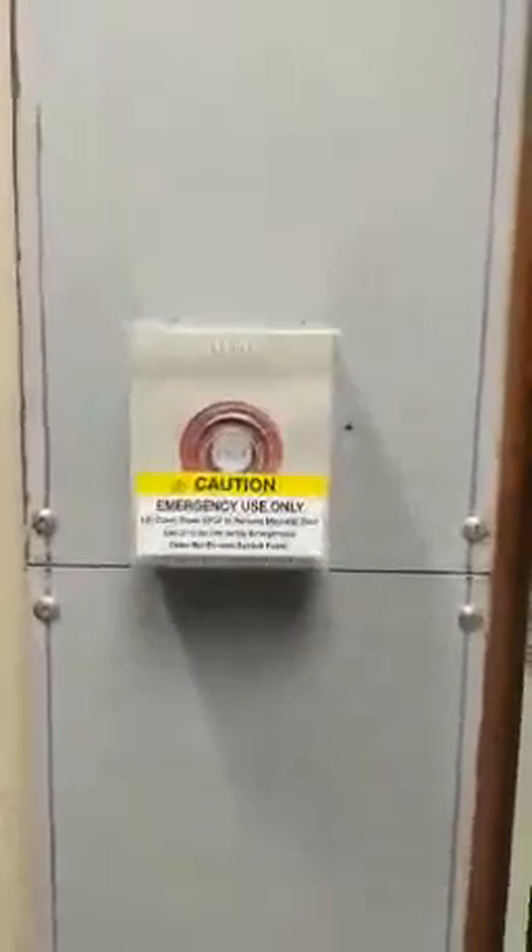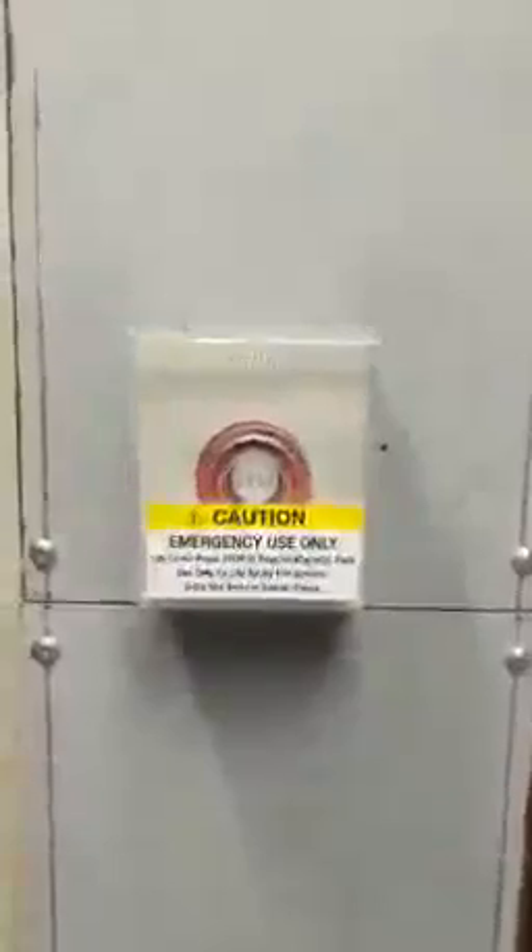This button will evacuate all helium from the scanner and shut down the magnetic field. As stated on the cover, it is only to be used in life-threatening emergencies.